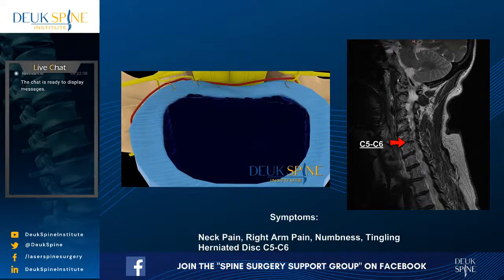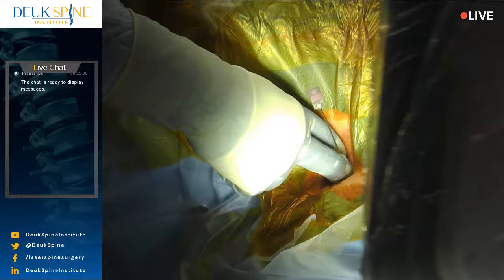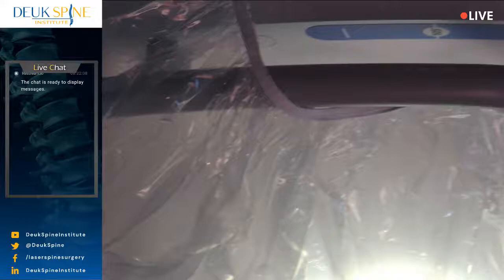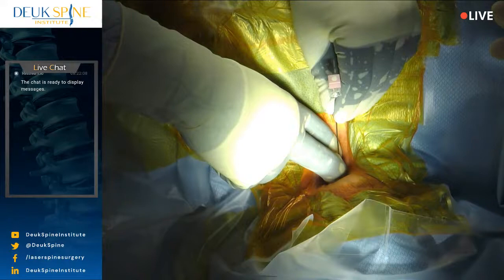Shot. All right, AP quick. So on the lateral view, we're at the 5-6 level. 2, 3, 4, 5, 6, we're using an X-ray. But I want to see what the AP view shows, a little bit to her right. So I'm going to come back and reposition. Shot. That's good. Now go back to a lateral. So we're at the 5-6 level in the middle, and we're going to enter the disc from the front.